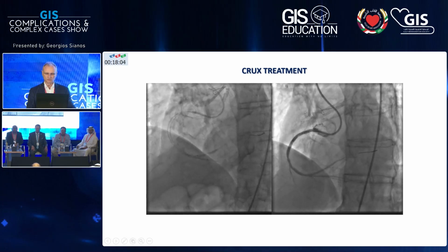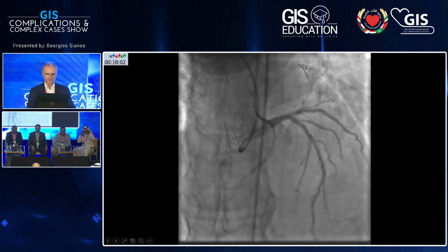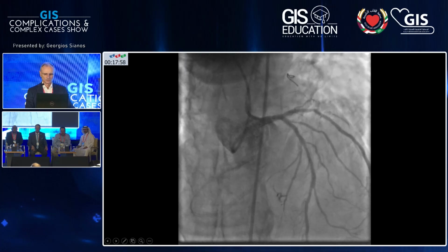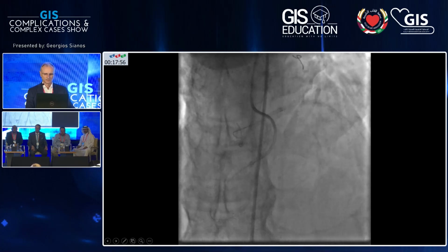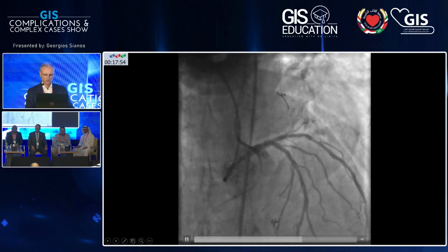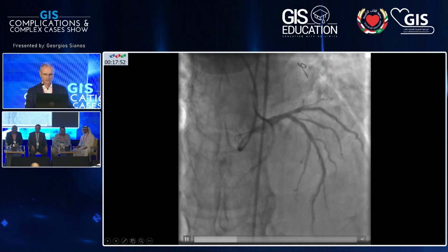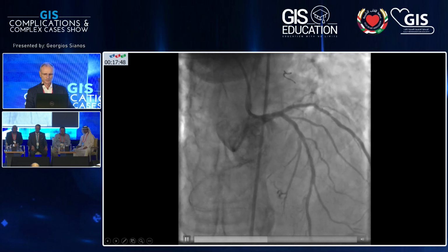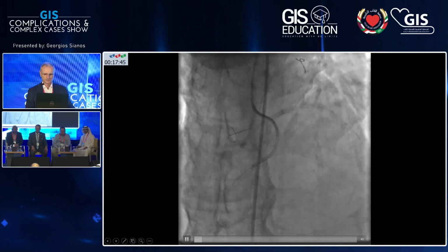It was not very easy to advance materials there. So during the procedure, we struggled to bring materials down. And when you push things, the wires keep going in and out. And suddenly, without much attention, there was an epicardial collateral from the LCX. You can see it here.